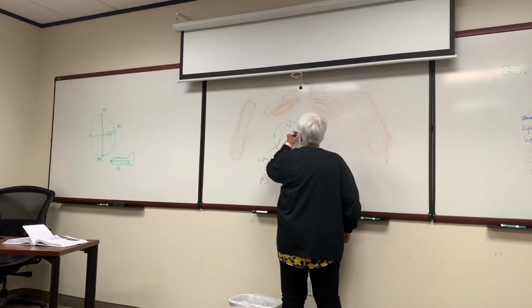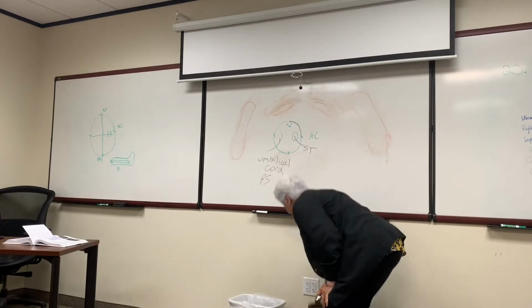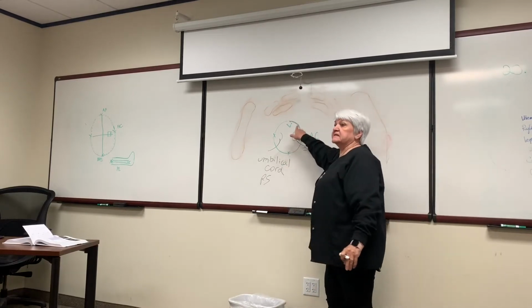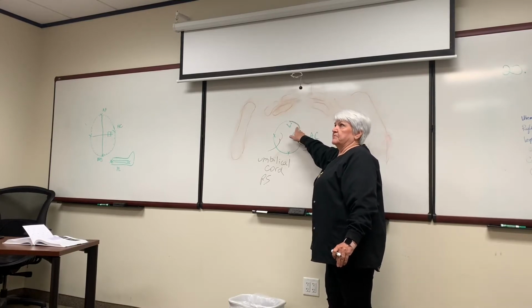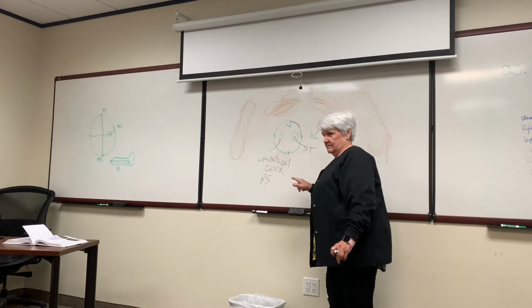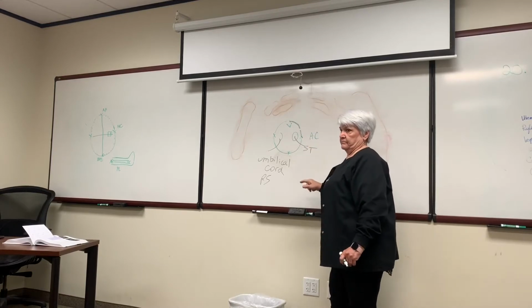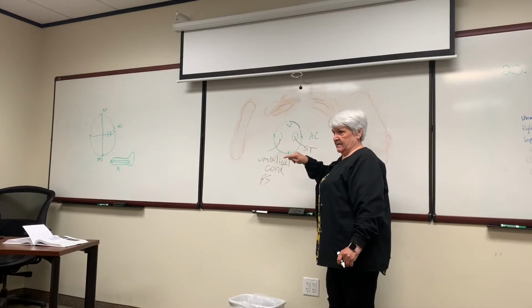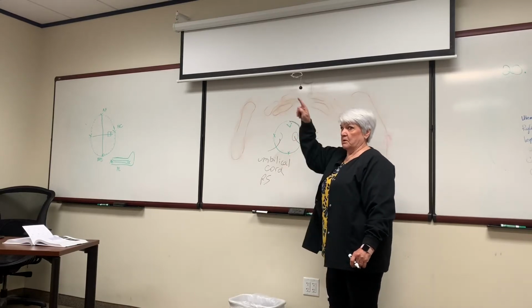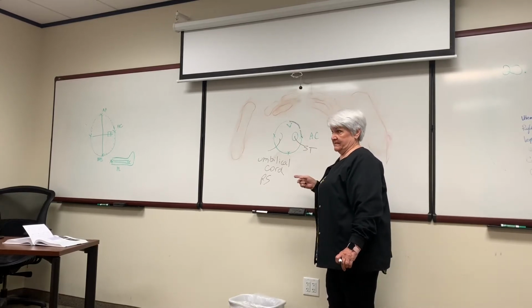sometimes it will play like this is a skin, and then you'll have a hypoechoic ring right underneath this. This is not ascites, okay? It's pseudo-ascites, okay? And you'll see it all the way around. It's just the muscle under the skin during development. It'll be a hypoechoic ring. And some sonographers will get it confused with ascites.